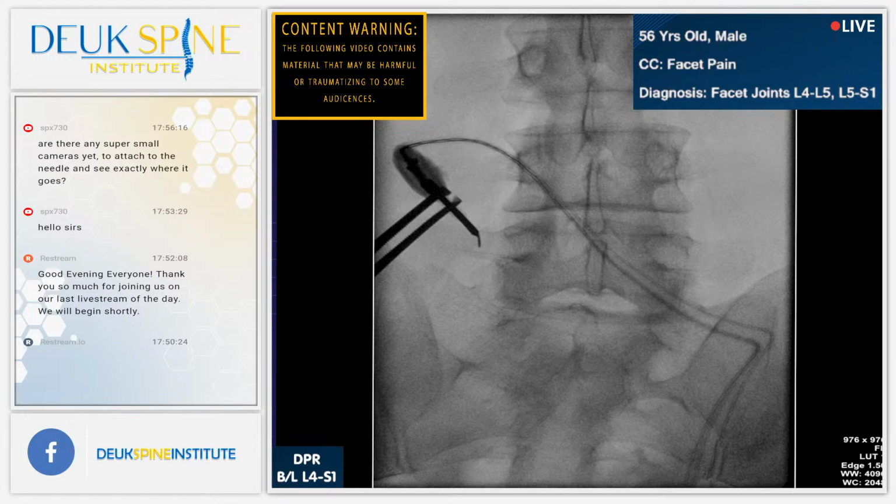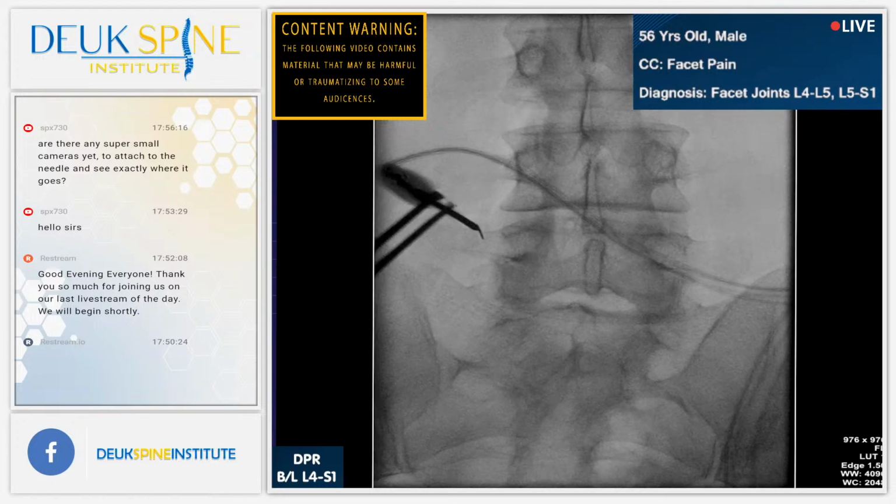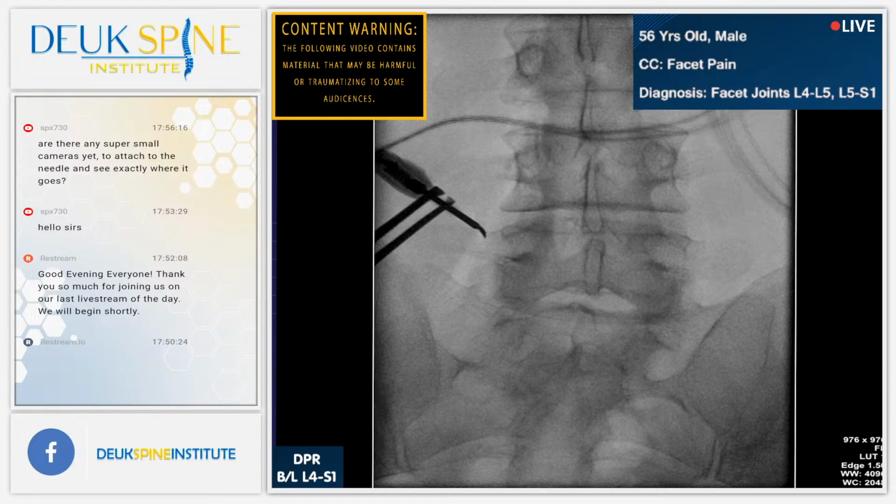All right, shot. Once again, I need to find the junction of the transverse process and the superior facet, which is right here. Our goal is to get rid of that bad nerve, the pain nerve. Shot. It's pretty much right where I'm at, right, Jordan? Yes, sir. I couldn't get a better place than this. I feel the superior facet, I feel the transverse process. I actually feel the mammillary process along the TP.